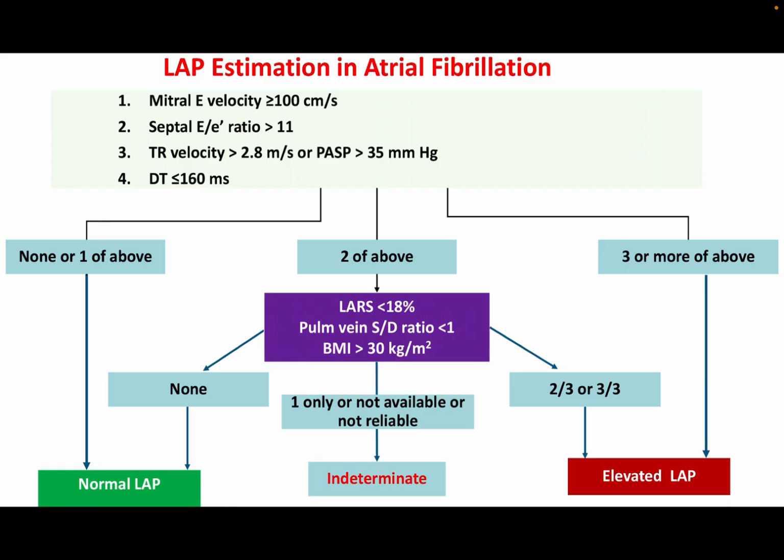Atrial fibrillation algorithm. This is the visual summary coming from the guidelines. This visual shows the atrial fibrillation specific algorithm, and you can commit it to memory to determine patients with elevated left atrial pressure, normal left atrial pressure, or indeterminate.